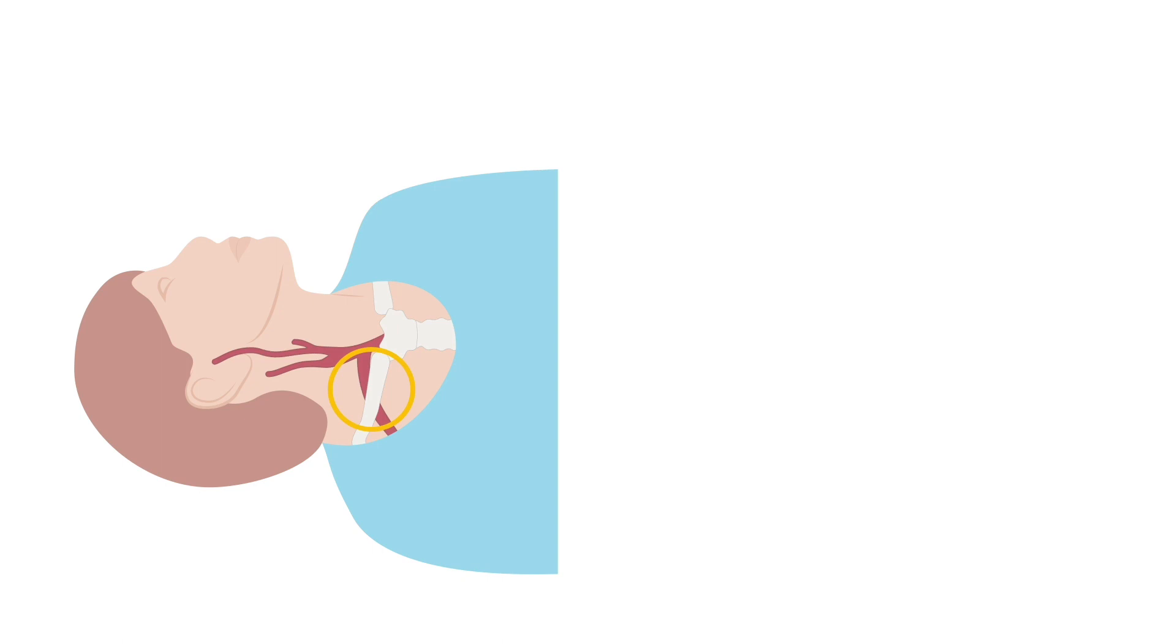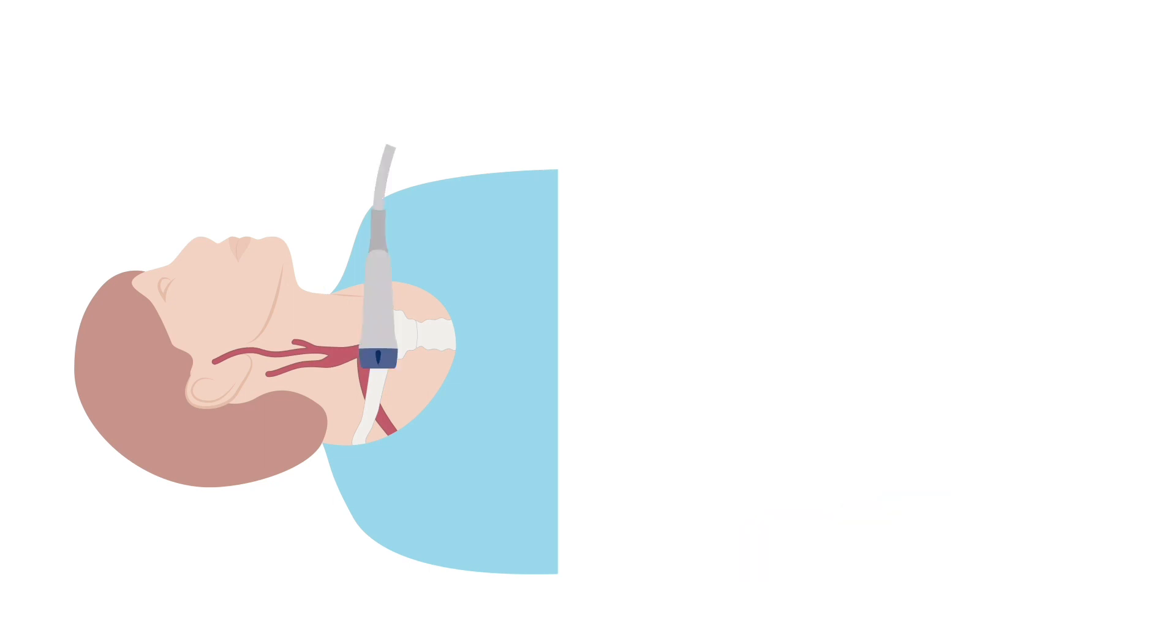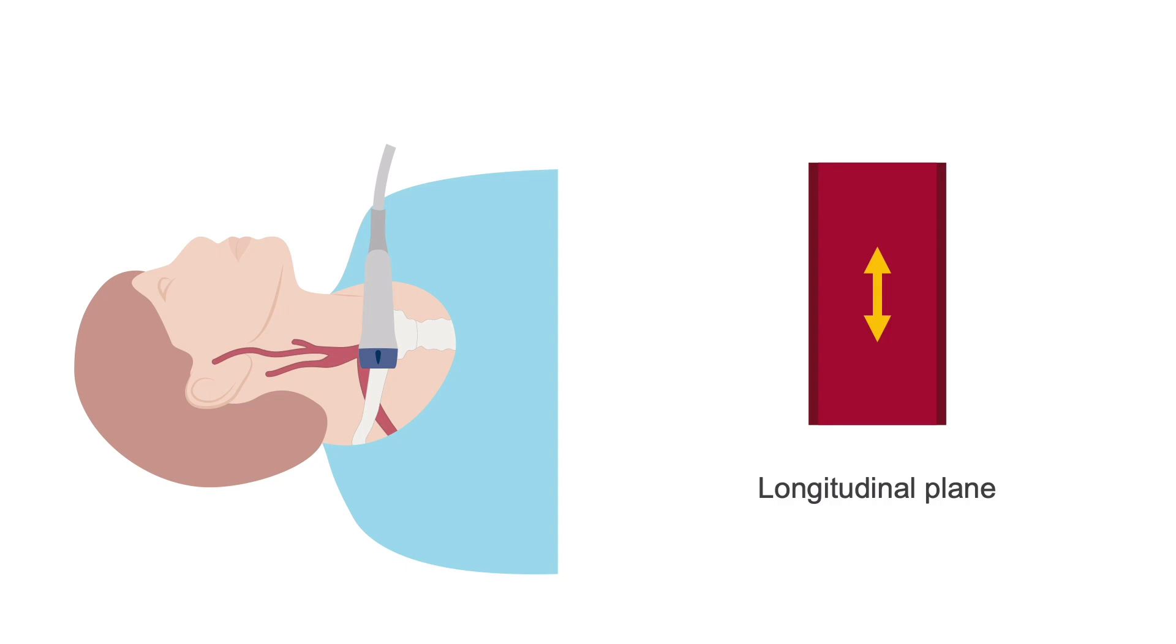To help with this, ask the patient to relax their shoulder down and turn the head a little further to the left, away from the side that is being scanned. Using plenty of gel, position the probe in the supraclavicular notch and adjust the position of the probe to obtain a longitudinal view of the subclavian artery.